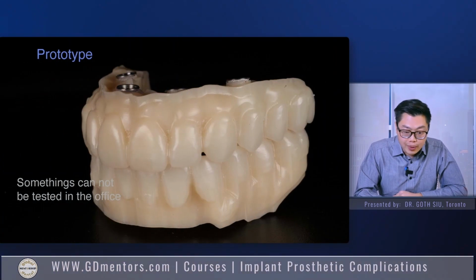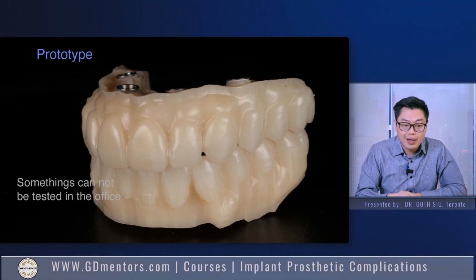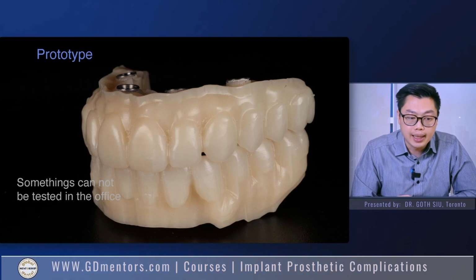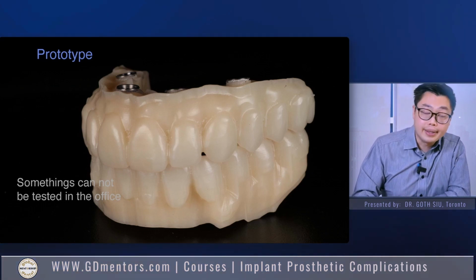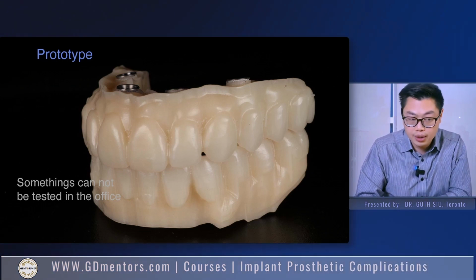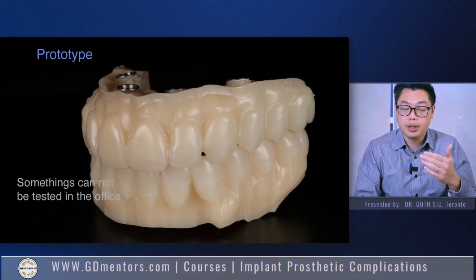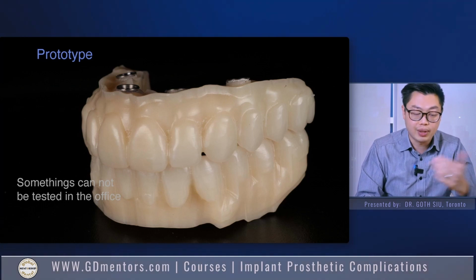In some situations, not saying you have to do it 100% of the time, it may be beneficial to put prototypes into the patient first, let them function for a few weeks before moving towards the final, more expensive restoration.